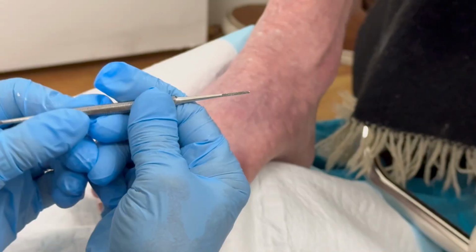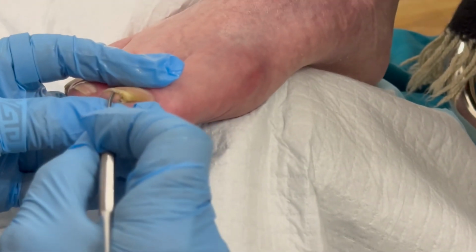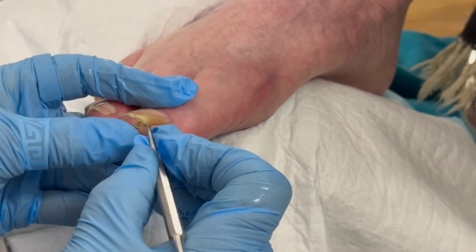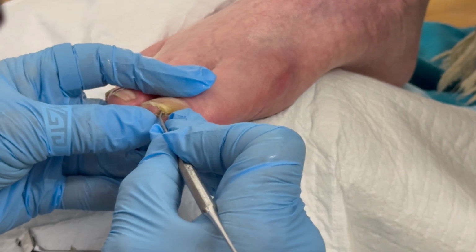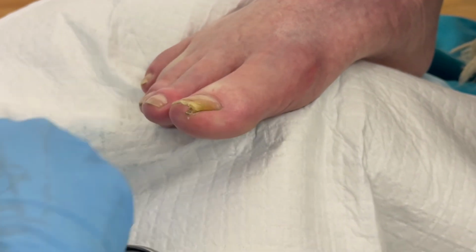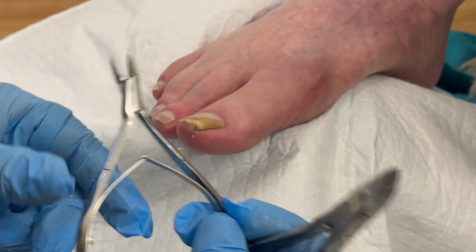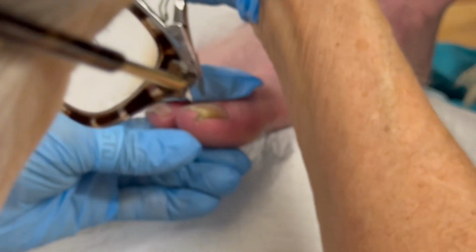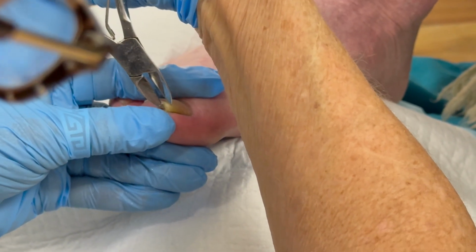I have a little sterile file rasp, straight on one side, curved on the other, doesn't really matter. And what I do is just kind of get in here and try to, am I torturing you too much yet? Not yet, he says. Okay. So I'm using this thicker one. I'm going to go in later with the thinner one, but I'm using the thick for this thick part of the nail because it could damage those nippers. So I'm going in.